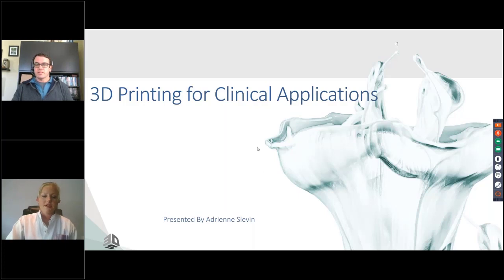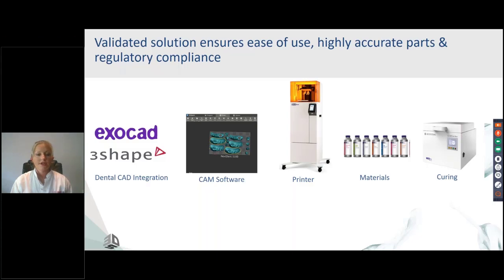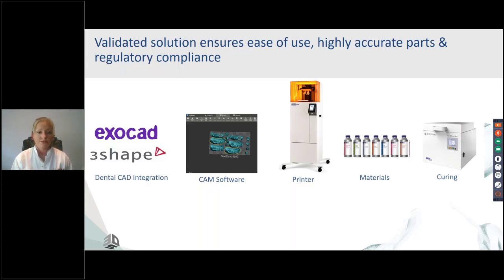So a couple things here. As Lucas said, we do have a great integration, and there's a lot of things that come into play when you are going digital. You're probably already digital to a certain extent, but every time you bring something new in-house, it is a little bit of a learning curve, and sometimes it's a big learning curve. So what we've done is we've worked with Exocad and other dental CAD softwares, and we've made sure that we can take as much of that trial and error out of it as possible. So we validated a full workflow from beginning to end to help people go digital, whether it's in their lab or their clinic.